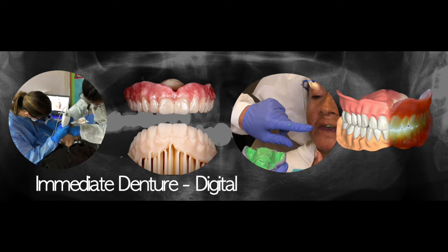When it comes to the immediate denture digitally, the steps will be shortened to three. At first, we are going to make an intraoral scan. Second, we'll fabricate the try-in denture, which is printed, and deliver this try-in denture. Last, before you make the final prosthesis, we take the wash impression using the try-in denture, then rescan the new surface after the tissue heals, and then we deliver and make the immediate denture.